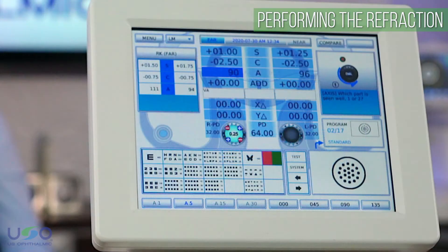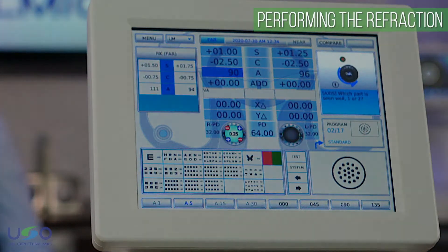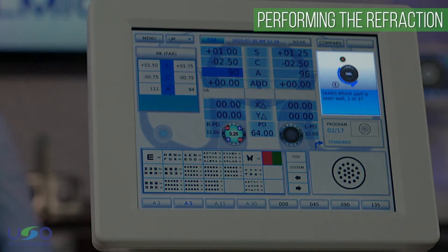For example, if the patient selects option 1, the guide window will suggest rotating the knob counterclockwise, and if they select option 2, it will suggest a clockwise rotation instead.